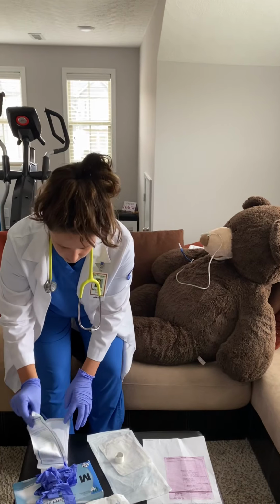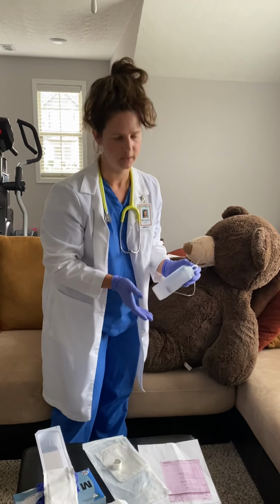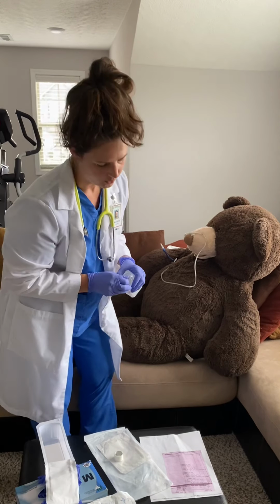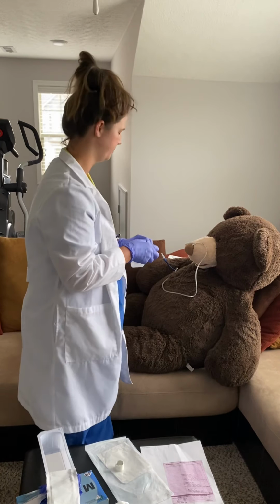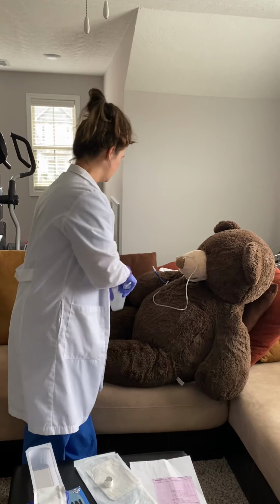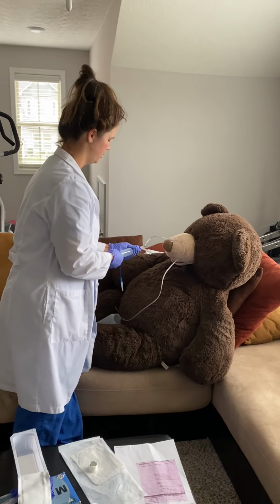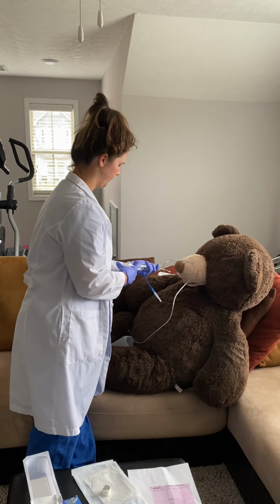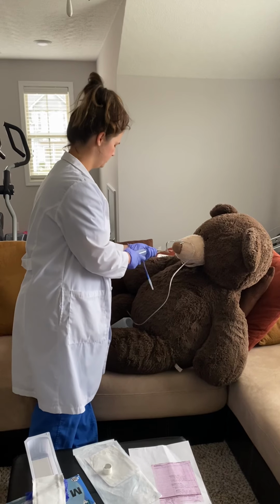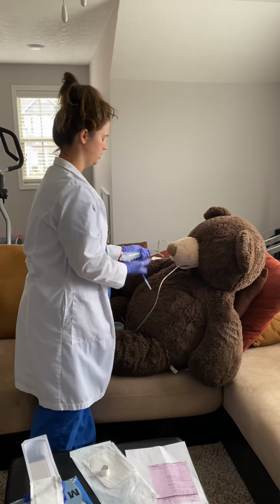And you're going to be taking your syringe, tube, and container. And per this order, we're going to be doing normal saline, 0.9%, and we're going to be lavaging until the contents are clear. Okay, so you want to push fluid in and then aspirate out and continue doing that until clear. So you would draw up your fluid. Unanchor right here. And then you want to push in your fluid. And then aspirate out. And done. And then continue doing that. You would draw up more fluid and push in. Continue doing that until it's clear.